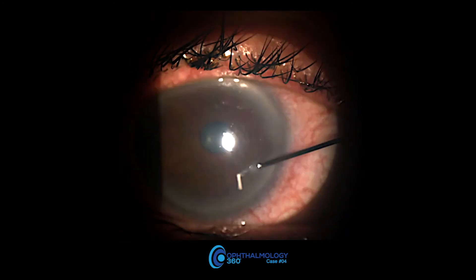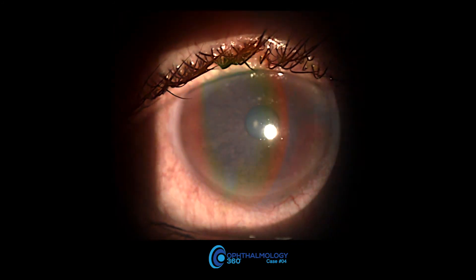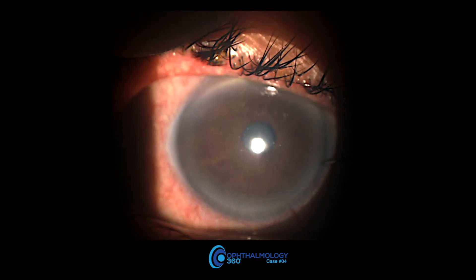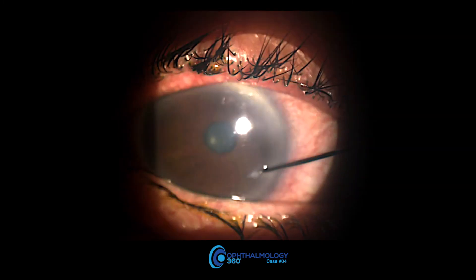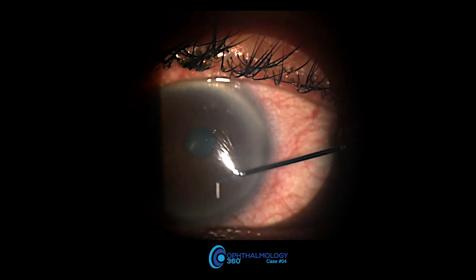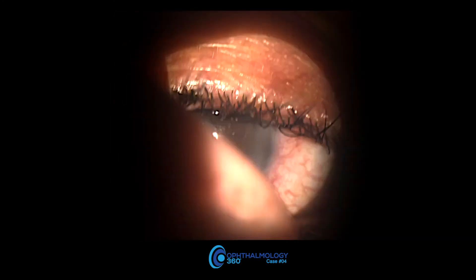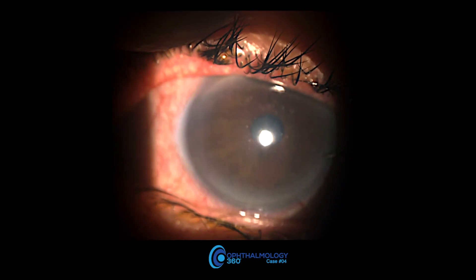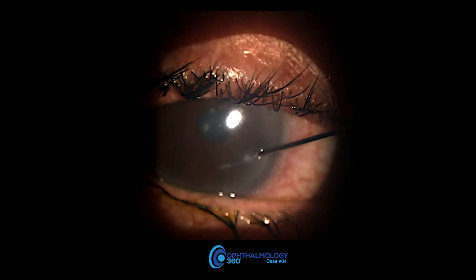I have a pretty acute angle there, which I think is really preferable as far as insertion. You can't always get it that way, but no matter what you do, sometimes that implant is going to want to adhere. I just go back and forth a little bit, and it comes down like a log tunneling down, and it finds its home somewhere between 5:30 and 6:30 almost always.